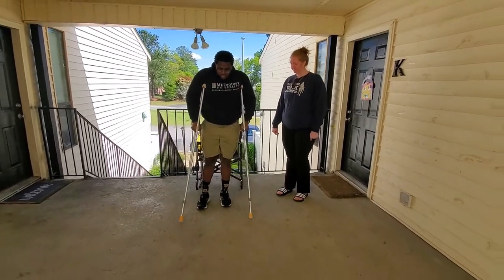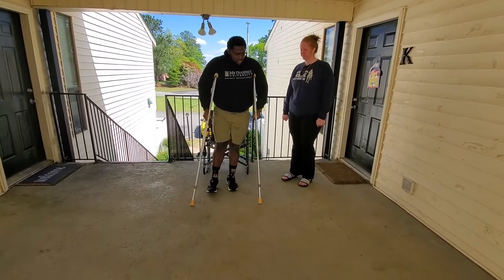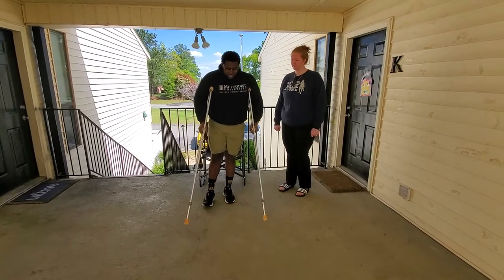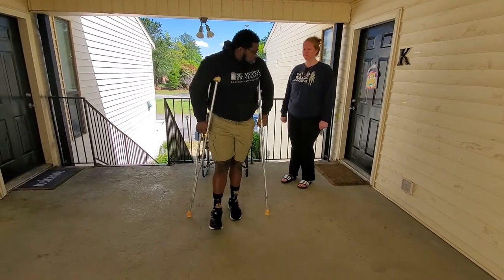You just want the crutches out in front just a little bit and minimal weight on that leg. I'm going to show you what's called a three-point step-to gait pattern. All that really means is that three points of contact will be on the ground — you're going to step with the crutches, then your good foot to the crutch.